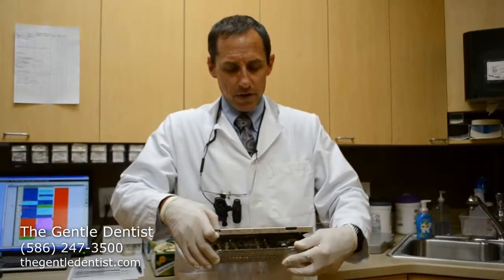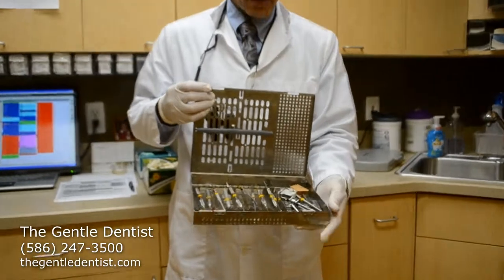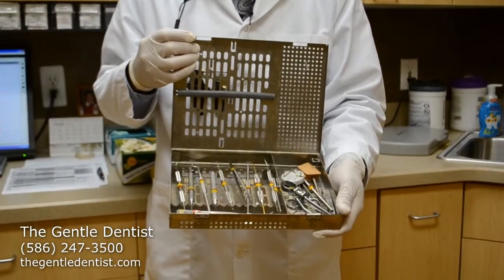So we have here what's called a cassette, and in this cassette there are instruments. As you can see, I'm going to open this up here, and this is a set of instruments that we use for all of our procedures.